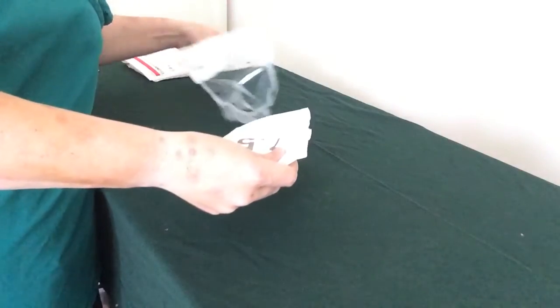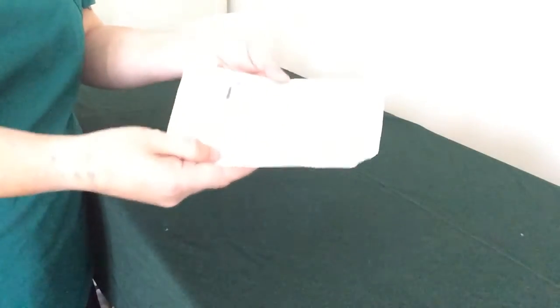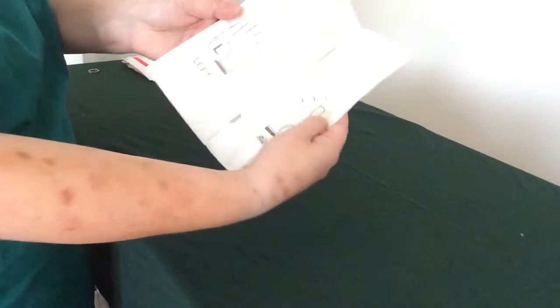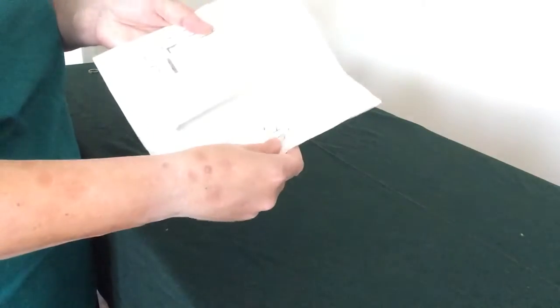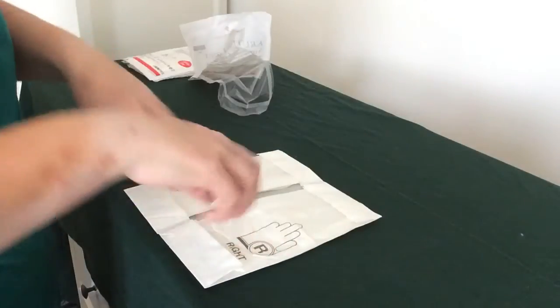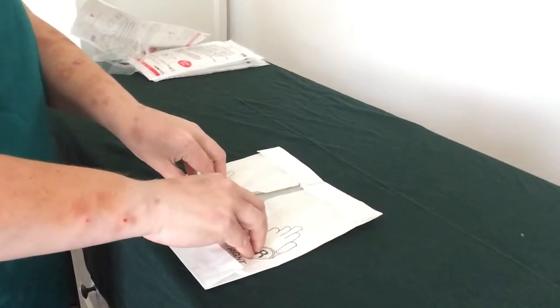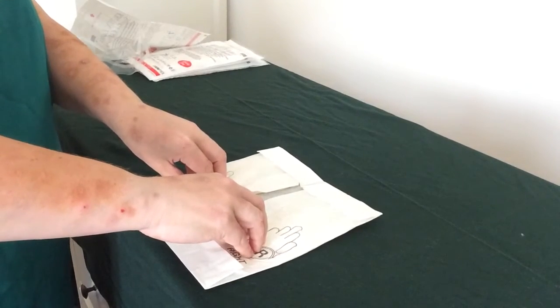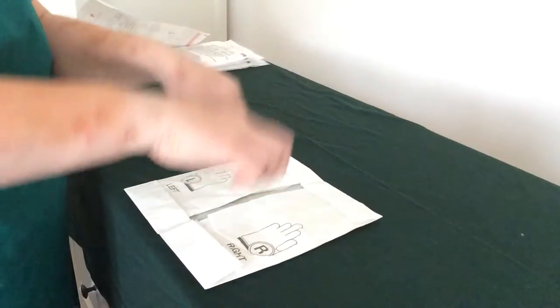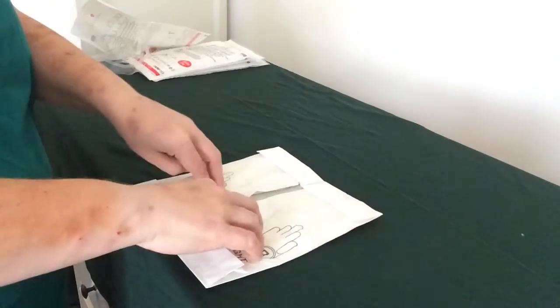So we've got open gloving. What I'm going to do is hold it, put my thumb in — it's pointing the right way. Open gloving just means the open part faces me. Now you will get a sterile area to work in. It's a good trick when you're practicing: if you think you're breaking sterility, say it out loud — 'I've broken sterility' — because you can stop and redo at any point in the exam. When I'm doing this, I practice not touching any of the sterile area.